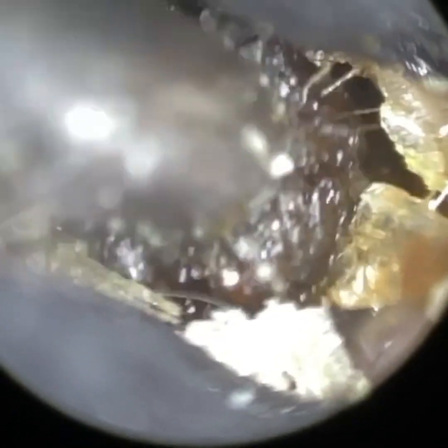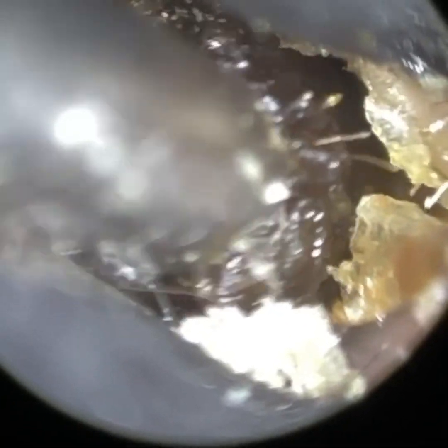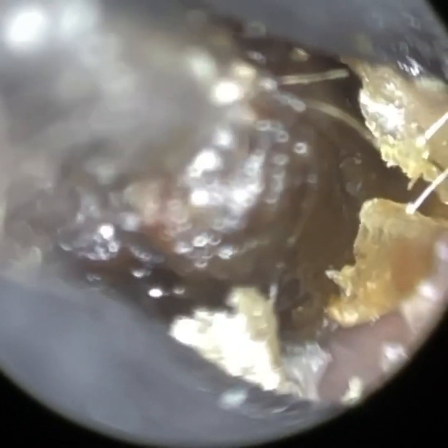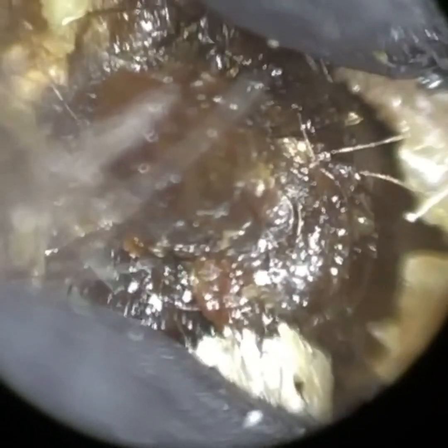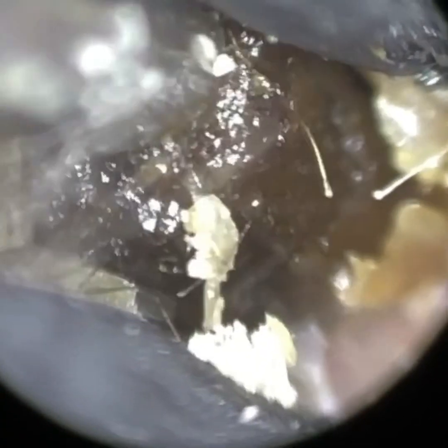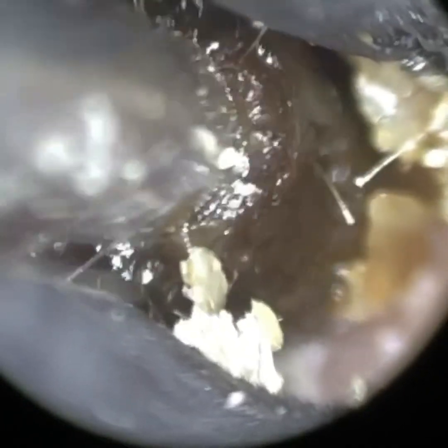Another feature called motion parallax: when you're moving the instrument forward and backwards, by the relative speed and change of where you are in the ear, that gives you depth perception. But quite simply with the Waxscope, you get the object in focus, and when you're in focus, you've got your depth. So it's quite straightforward in that respect.